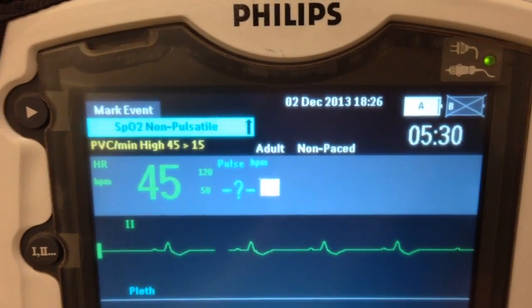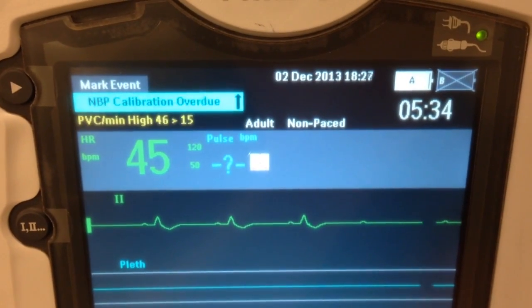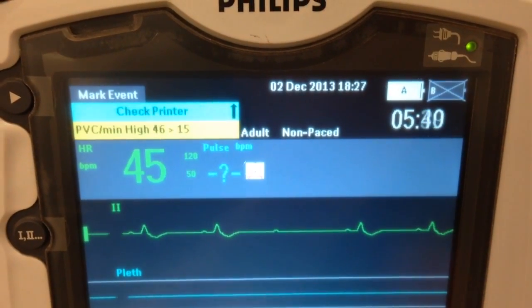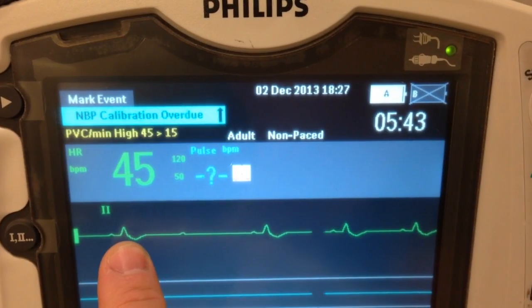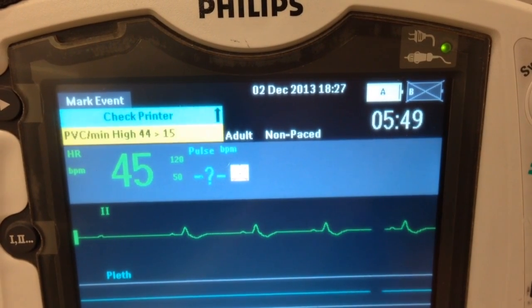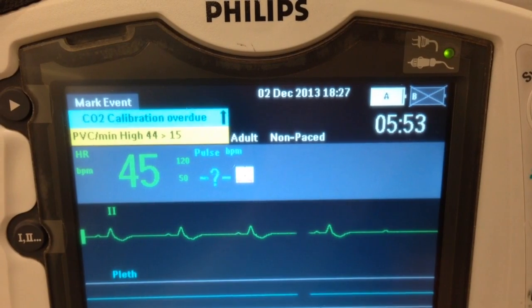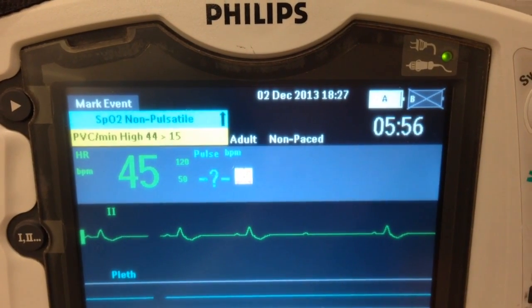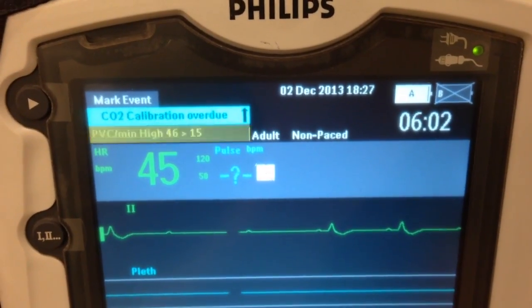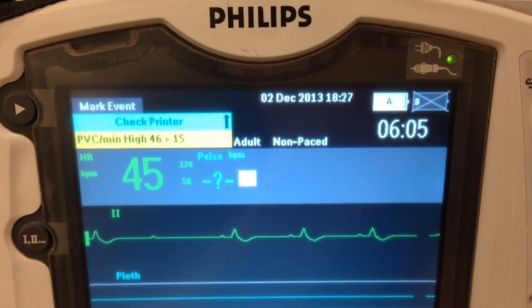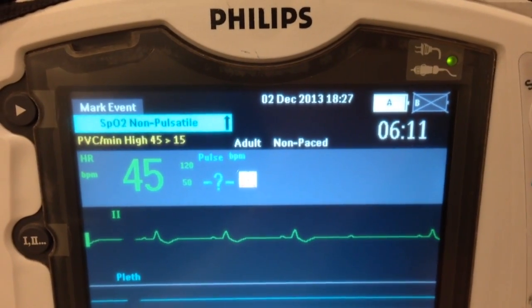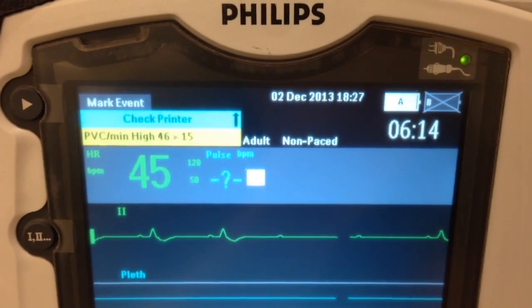Sometimes the QRS drop is random; other times there is a method to the madness. In this case, I have a 3-to-1 block, where 3 P waves get through and then 1 P wave gets dropped. So here's 1, 2, 3, and drop — 1, 2, 3, and drop — repeating. So there is a pattern, but the pattern is not the P-to-R interval. The pattern is how many beats occur between a drop. In this case it is what we call a 3-to-1. Sometimes it can be a 2-to-1, depending on how bad the block is.